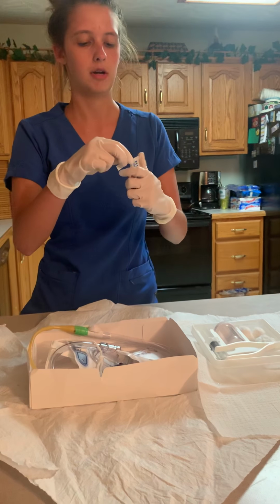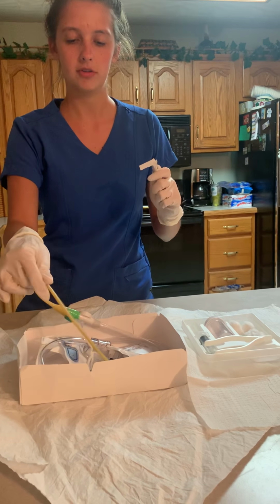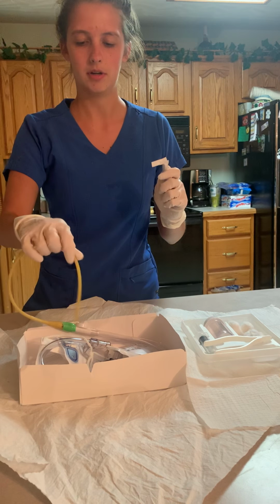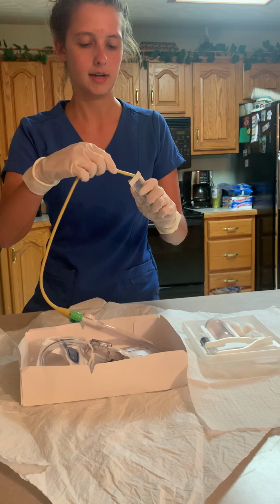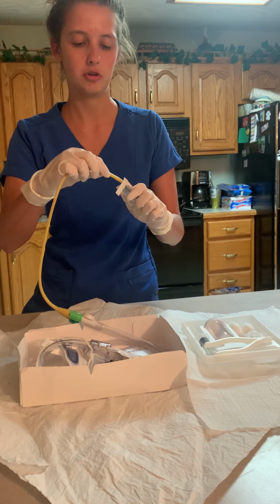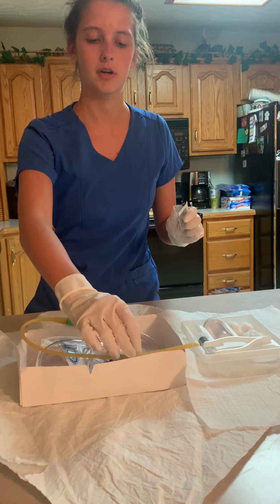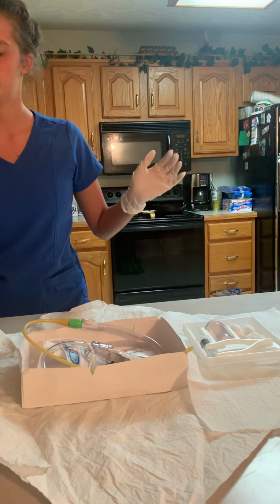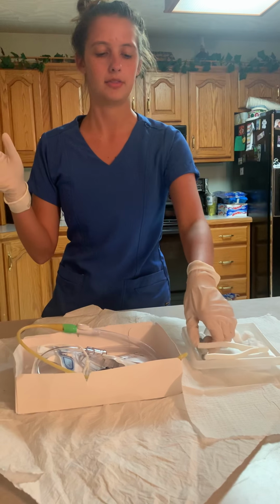So I'm going to open up my lubricant, and then I'm not going to cross over my sterile field. And I'm going to go ahead and lubricate my catheter. I'm not going to go more than 2 inches from the tip. Okay, then we're just going to let the catheter sit there until we're ready. And we're going to go out and away from the sterile field. Then I'm going to go ahead and attach my syringe to the catheter.